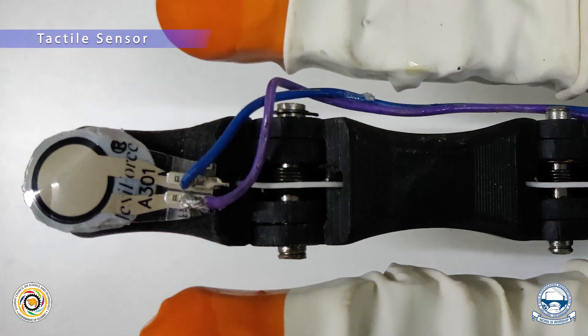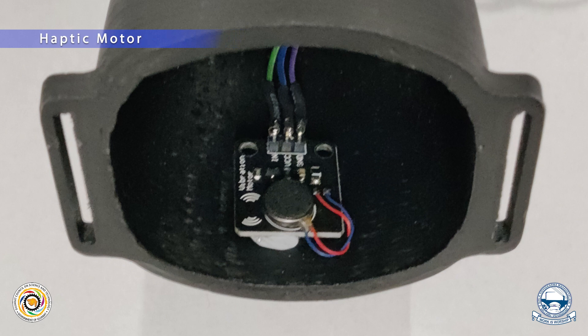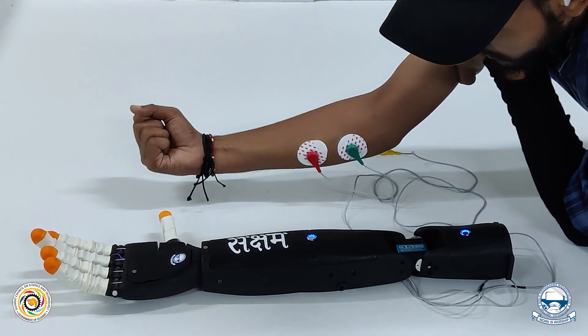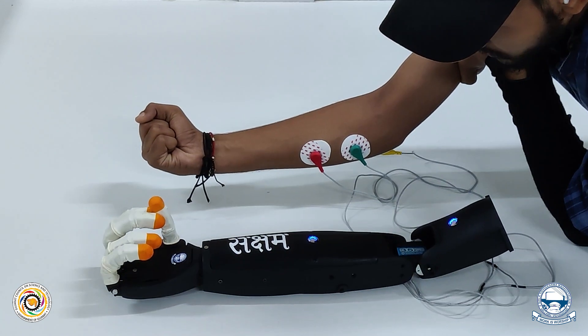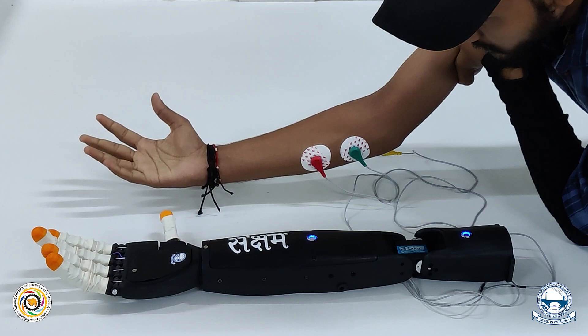Tactile sensors can sense precisely the measure of the force applied to the fingers, and the signals are transmitted to activate the haptic motor's state. A surface EMG sensor is used to feed the neural network the required data to make decisions — here, to decide when to actuate and when to relax the fingers.